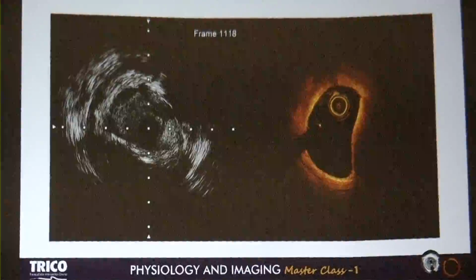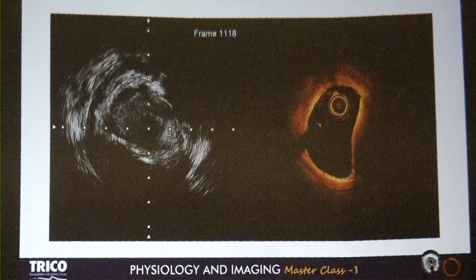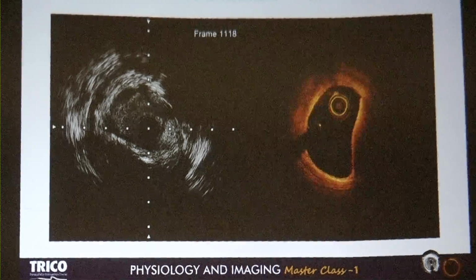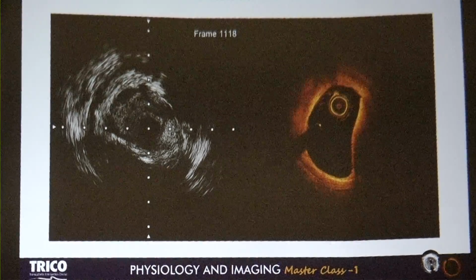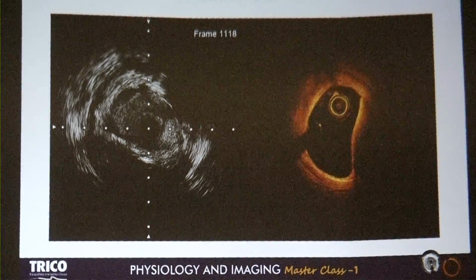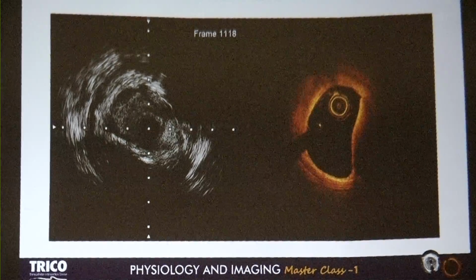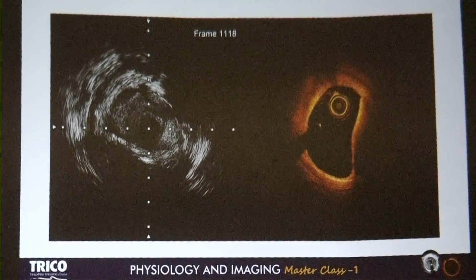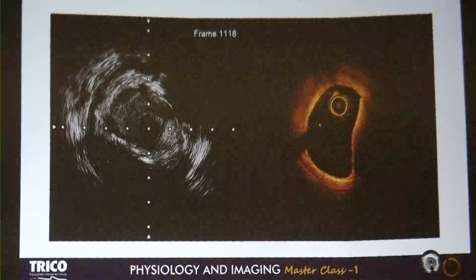Now you see both the images together, the same spot. Sometimes, because the OCT cannot visualize the very distal area, it can misinterpret hematoma as TCFA. And now I want your opinion, Professor. Yes, in this case the beam of the OCT is parallel to the distal portion of the hematoma.